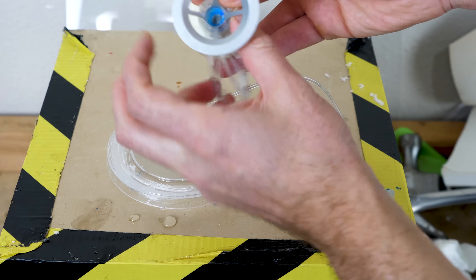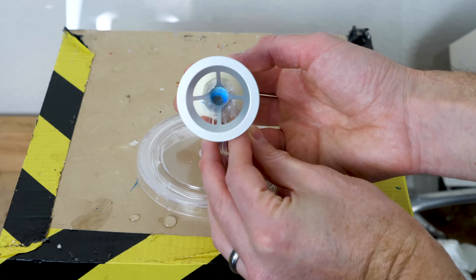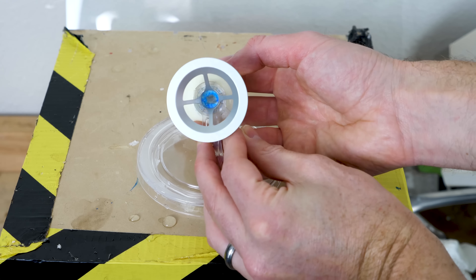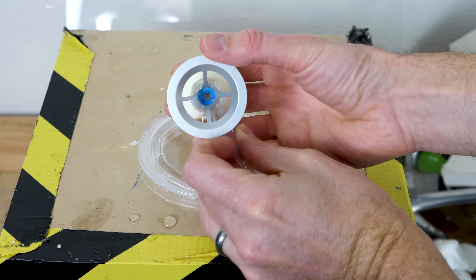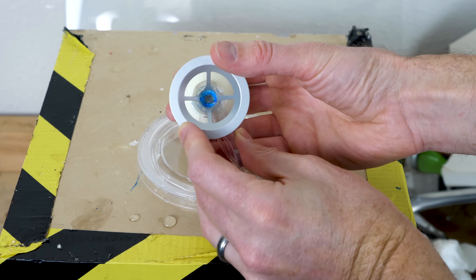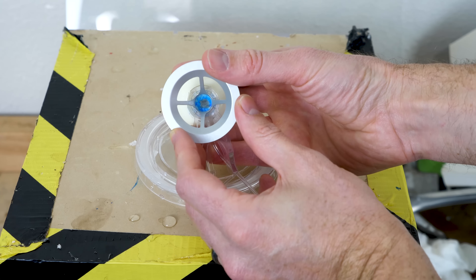It sucks the eye right up in there against the lens, so it does apply some pressure to it. It doesn't hurt because they put numbing drops in. This lens is pressed up against your eye, and now here's where they create a corneal flap.